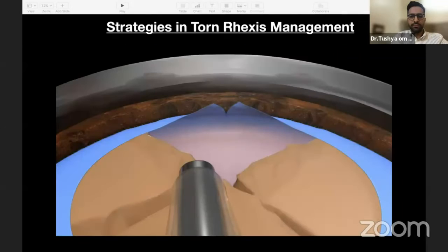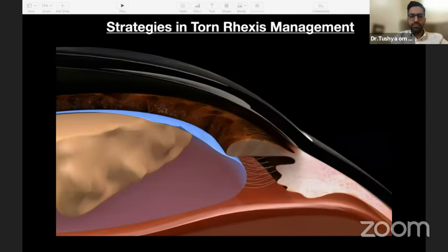For better explanation, these animations show that the pre-equatorial tear is everted and freely fluttering in nature. Hypothesis for fluttering flap is that the end point of the extension of the flap functions as the pivotal point for the flap. The flap, being short, is responsive to the fluid dynamics of the anterior chamber and thus flutters freely.